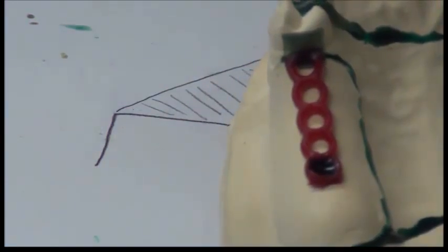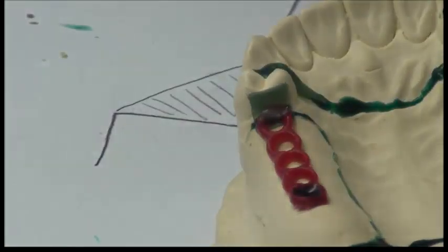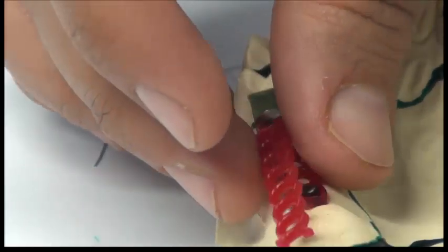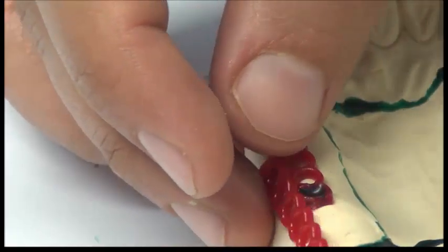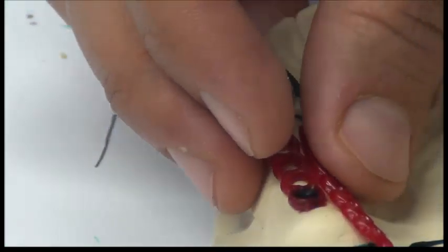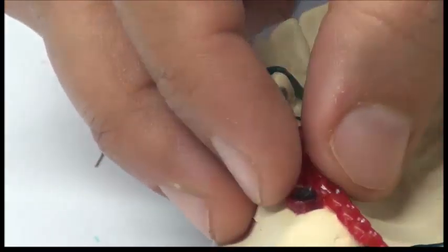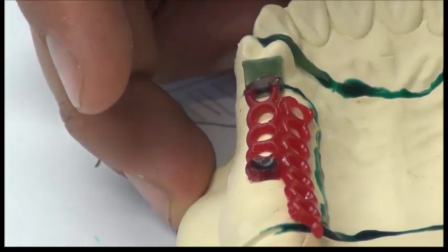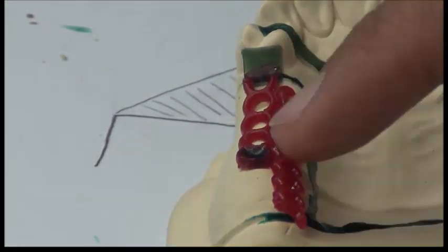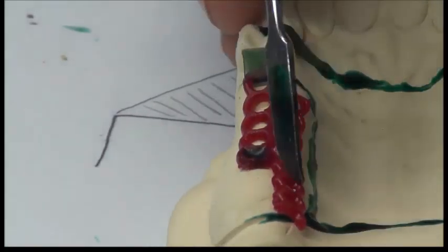For the upper, because the ridge is a bit wide, I could add another piece of wax, slightly buccal, and another small piece, slightly lingual. Okay? Because we have enough bulk in the upper. And I'm going to cut it in an oblique way here, and in an oblique way here, away from the tuberosity area.